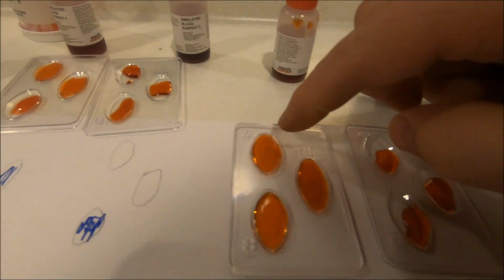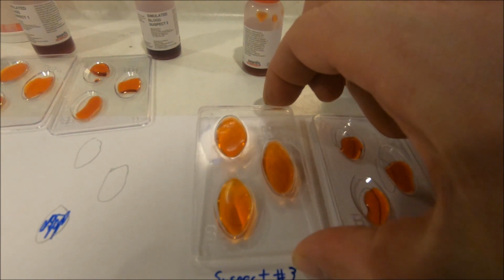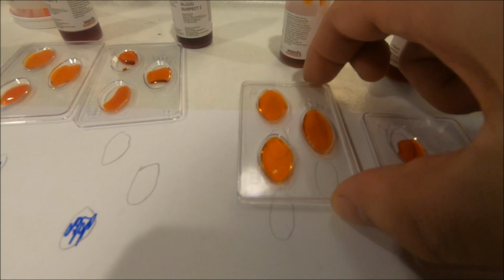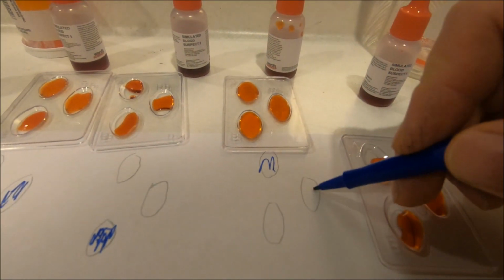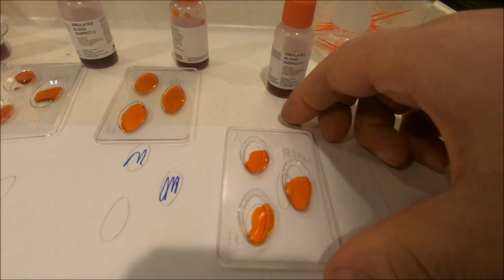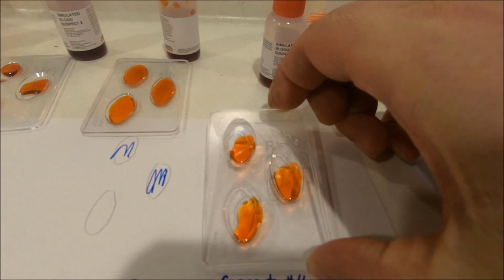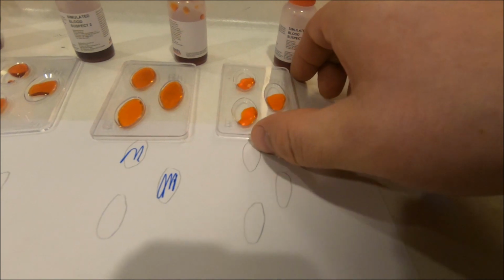From there, suspect 3: A has some clotting, the RH has some clotting, but the B slot is empty. So we're going to continue on, but leave that B spot empty. In our last suspect, suspect 4, all 3 slots are clear, no clotting or clumping occurring, so we're going to leave all 3 blank.